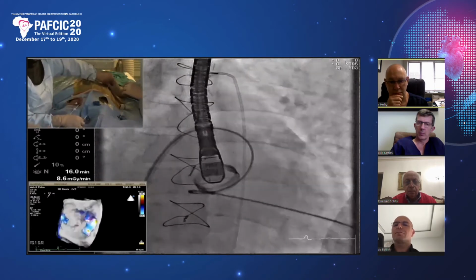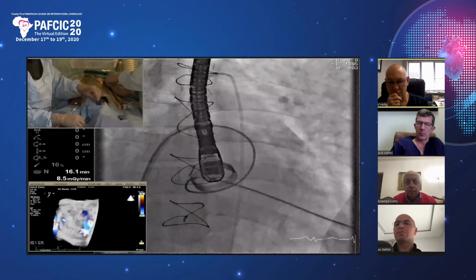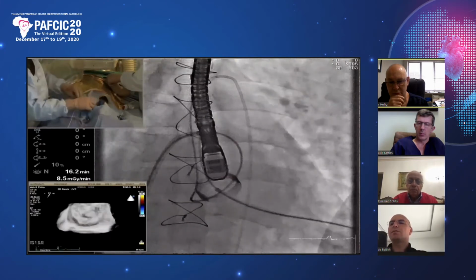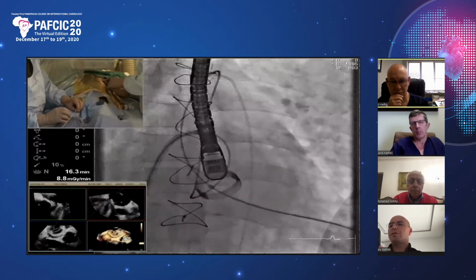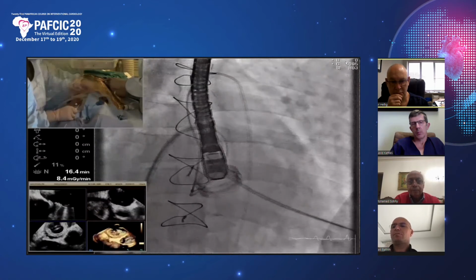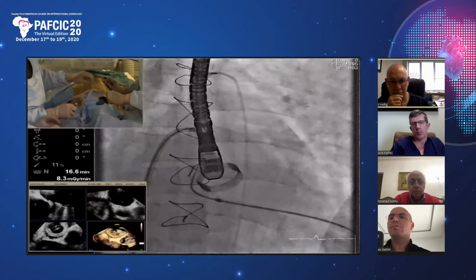So I'll ask Shaheen to push this all forward. So you're trying to now pull the wire and you're also pulling the antegrade catheter. Yes. Pay attention, wait until, stop. Don't push. Just be careful, you're going to run loose in here. Are you tight, Ralph? Oh, I still have it. We've got the wire. So if you just hold the wire tight, we'll straighten everything. Pull tight on the wire. Okay, now you can push the catheter while we hold the wire.